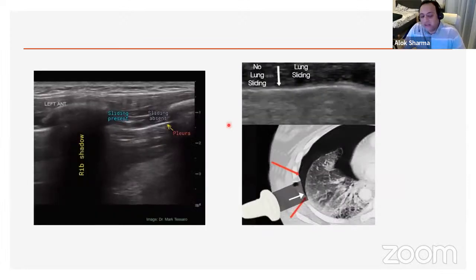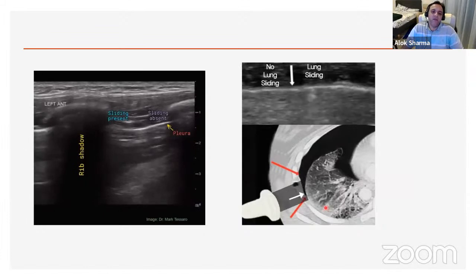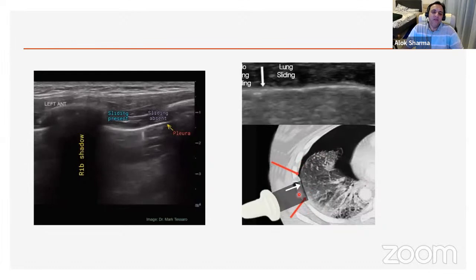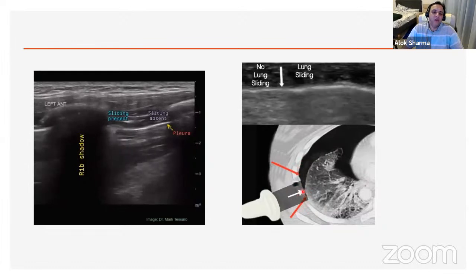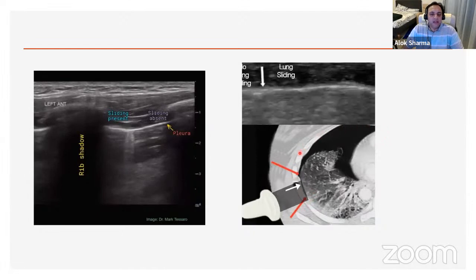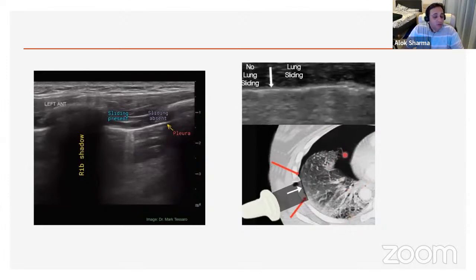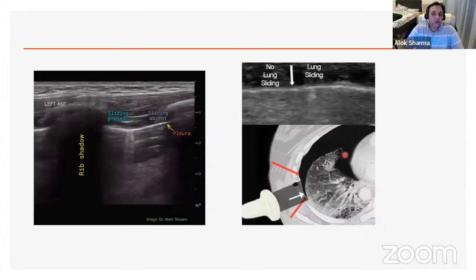Now, what is the lung point representing when you do an ultrasound? It's representing the area where the lung is expanding with the visceral and the parietal pleura coming into contact. You can see it very nicely in this image over here. Now, the pneumothorax is the air collection. If it's massive, and the lung collapses to just a nubbin because you have a tension pneumothorax, you might not be able to find a lung point. Experience says that those babies are usually very symptomatic.